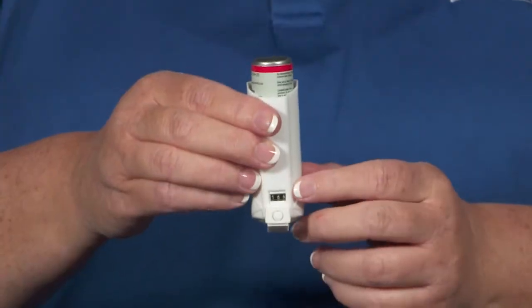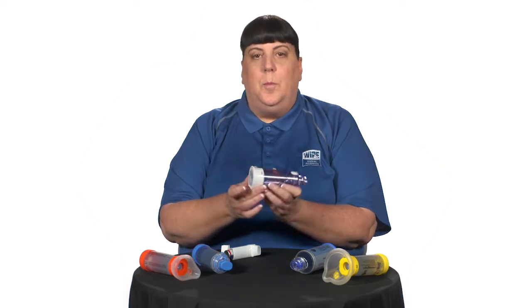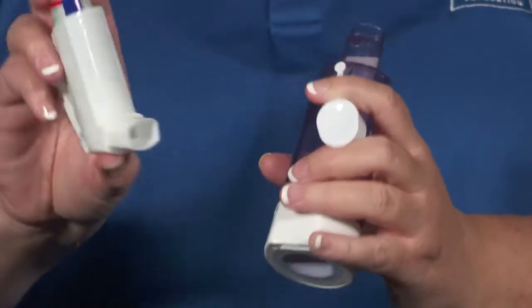When you're ready to take your dose of medicine, make sure the counter shows available doses. Start by removing the dust cap from the MDI mouthpiece and remove the dust cap from the valve holding chamber, and inspect the openings to make sure nothing is inside — like a coin or something else that might be dangerous if accidentally aspirated.